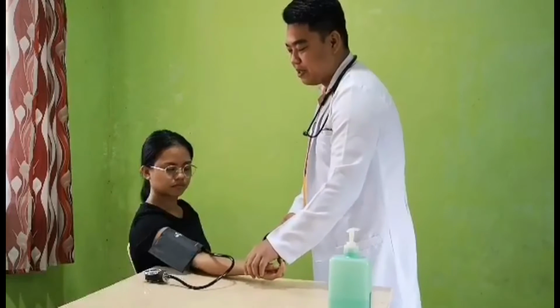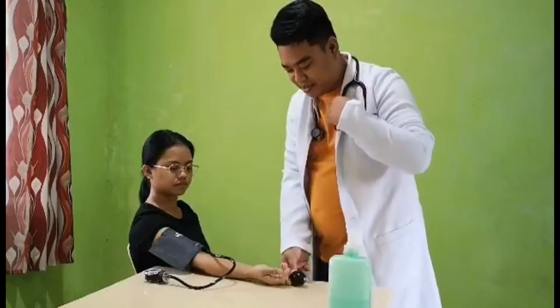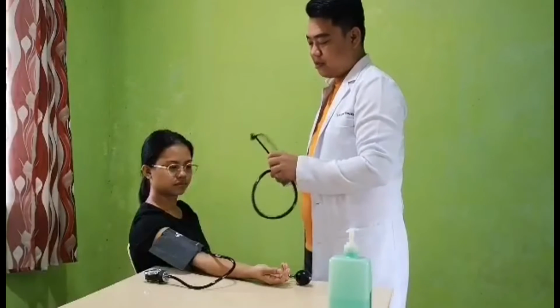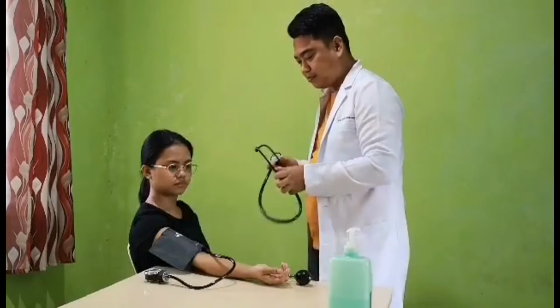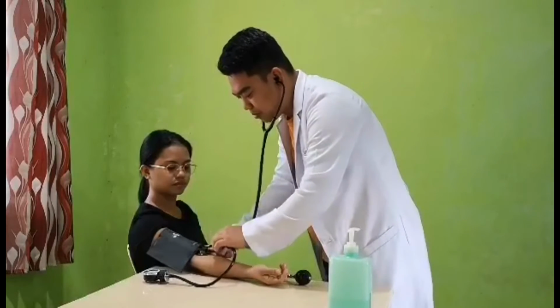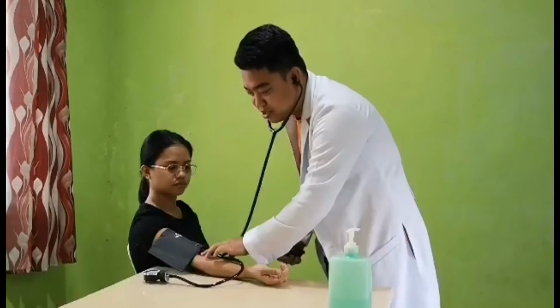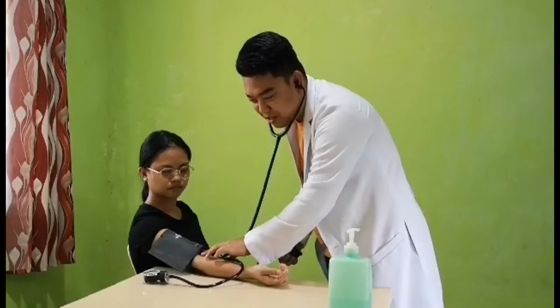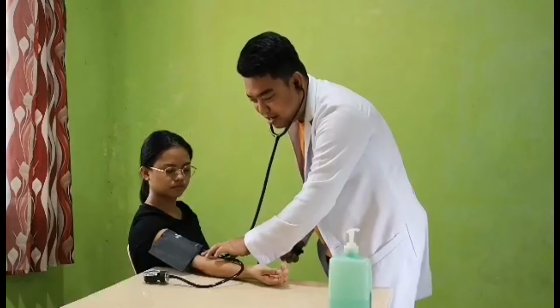Now I am going to determine the BP of my patient using the auscultatory method. Using the stethoscope, I am going to place the stethoscope over the brachial artery or at the level of the antecubital fossa or space. Earlier, I identified the approximate systolic BP of my patient at the level of 90 millimeters of mercury. Now, using the auscultatory method, I am going to add 20 to 30 millimeters of mercury to completely obstruct the artery of my patient.